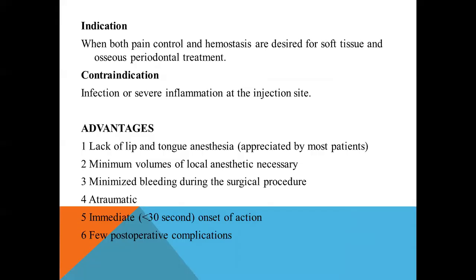What are all the advantages? Lack of lip and tongue anesthesia. A minimum volume of local anesthetic solution is required.